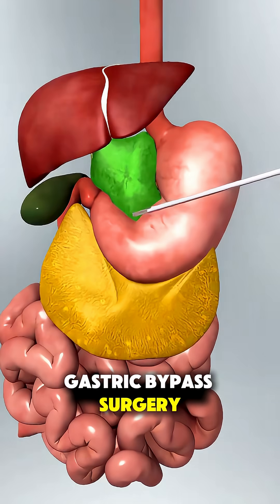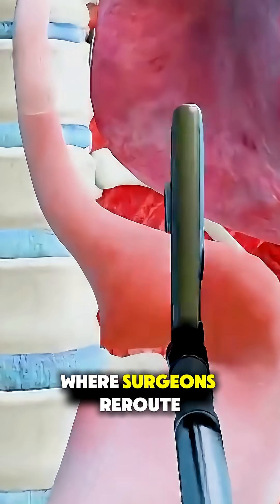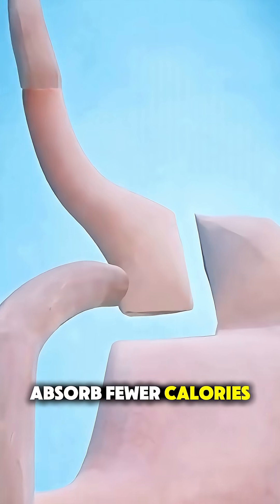Ever wonder how gastric bypass surgery is actually done? It's a powerful weight loss procedure where surgeons reroute the digestive system to help people eat less and absorb fewer calories.